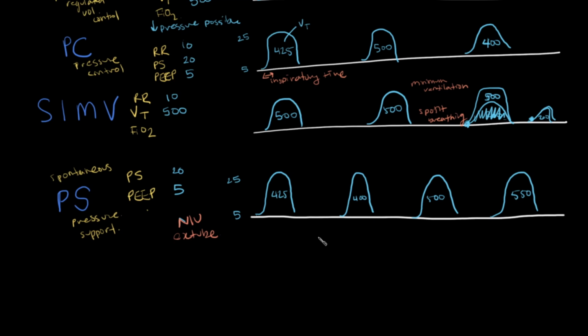And yeah, like before, lung pathology and particularly compliance will affect these numbers, so you will see them vary and go up and down. If the patient is extremely tachypnoeic and is really breathing fast and maintaining good tidal volumes, then yes, you'll develop a respiratory alkalosis, and conversely, if they're hypoventilating, then they will continue having a respiratory acidosis.